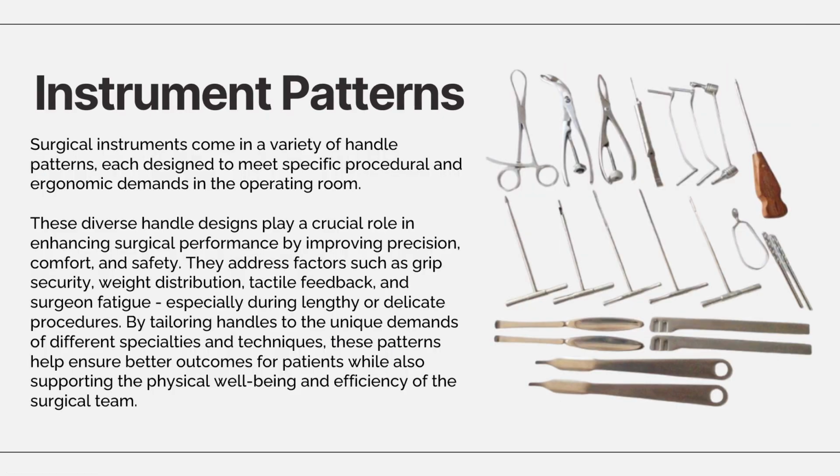And then there's instrument patterns. Surgical instruments feature a range of handle designs, each tailored to support specific surgical procedures, and it enhances user comfort and control. And when I say user, it's typically a surgeon, right? So these handle patterns are carefully engineered to meet ergonomic needs of the surgeon, so it reduces hand fatigue during lengthy surgeries, and it also provides precision in more delicate tasks.